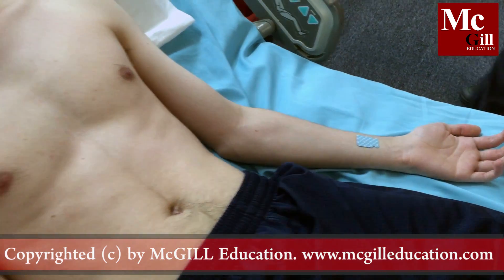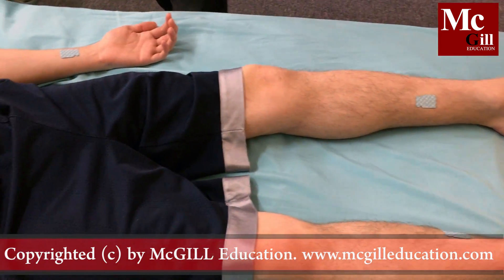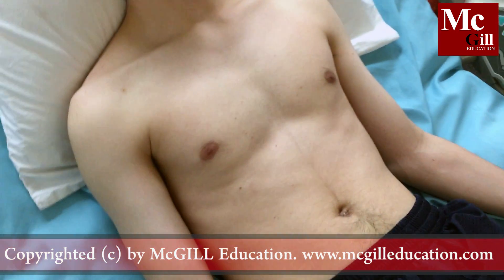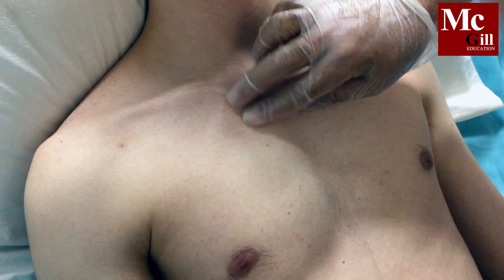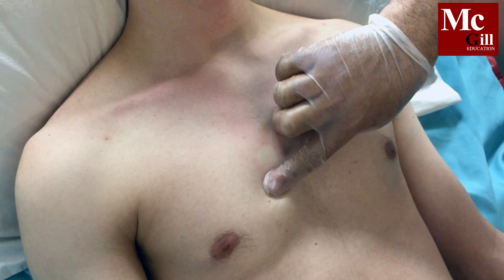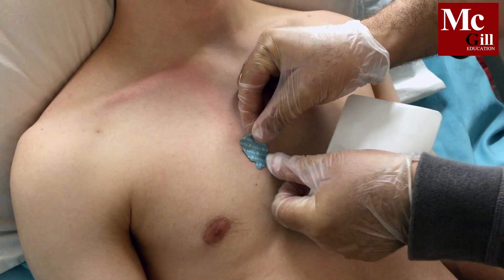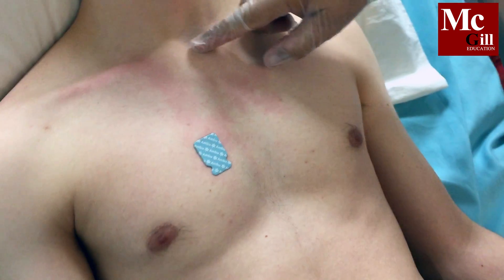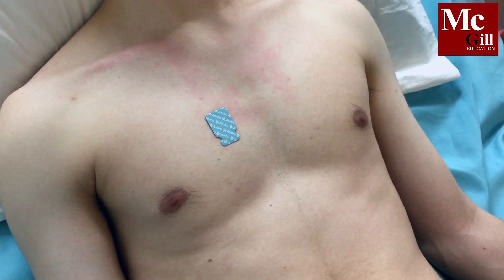Now you will apply precordial or chest electrodes. Avoid positioning the electrodes directly on bone. In females, position the electrodes below the breast tissue. Palpate the clavicle, or collarbone, and continue palpating downwards to the 4th rib, then move down slightly to the space between the 4th and 5th rib. Position V1 in the 4th intercostal space to the right of the sternum. Position V2 directly opposite V1 at the left sternal border in the 4th intercostal space.